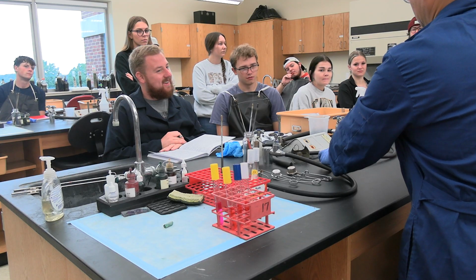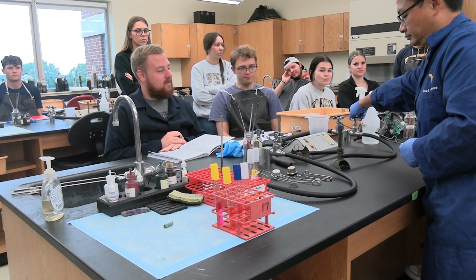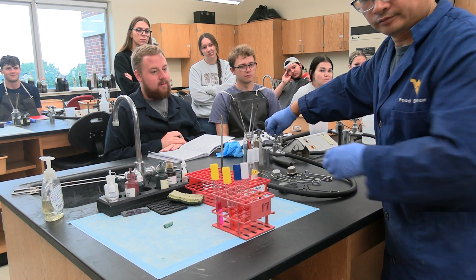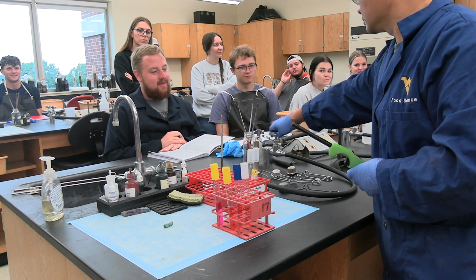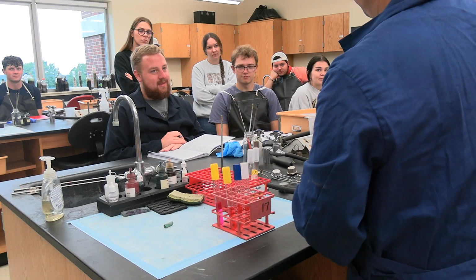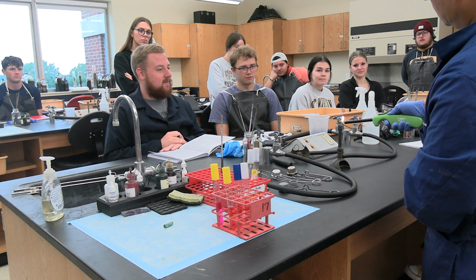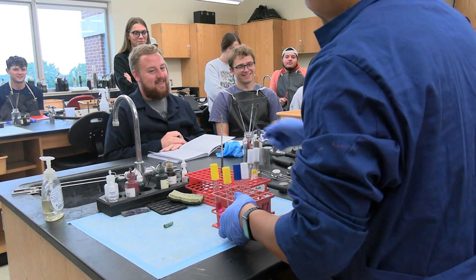Terrible. Yeah, use this one. No, man. That's not very scientific, okay? Don't do this all the time.